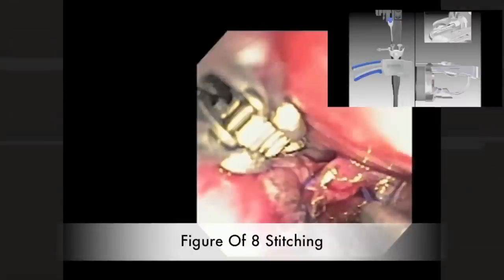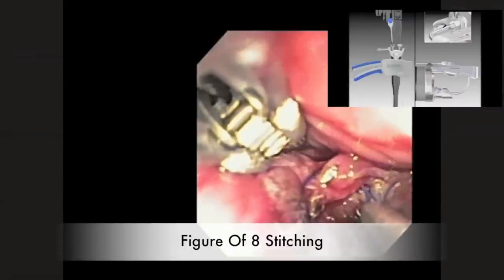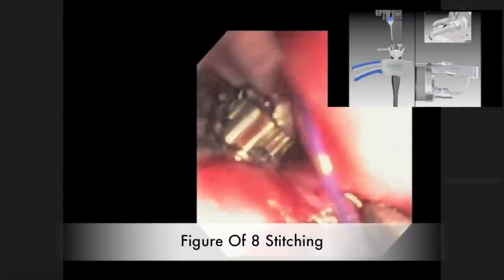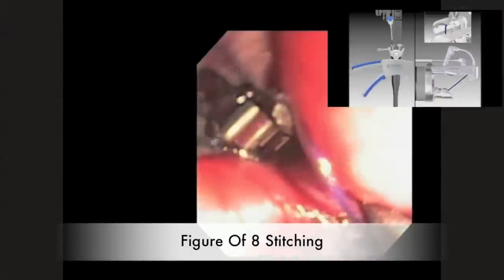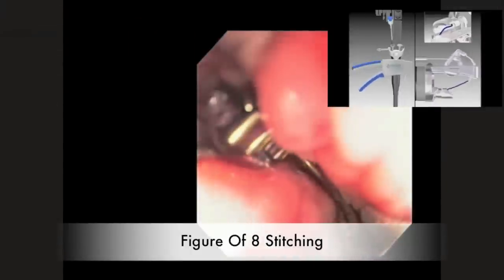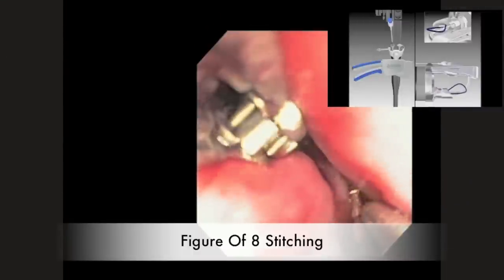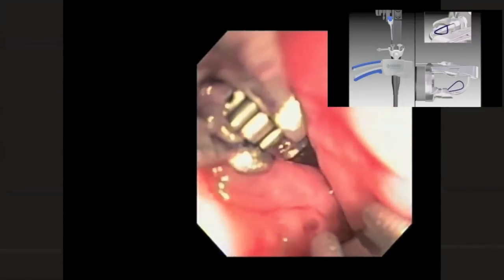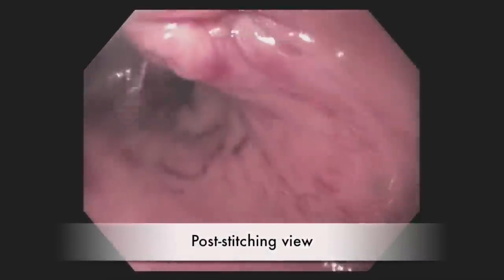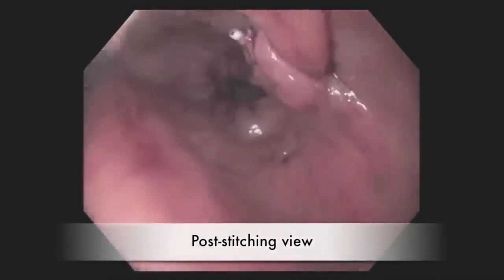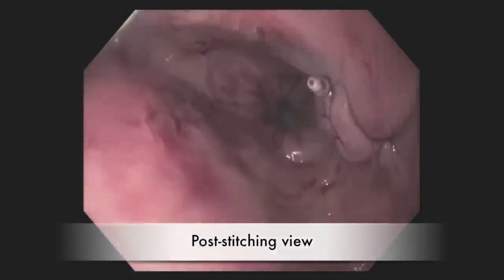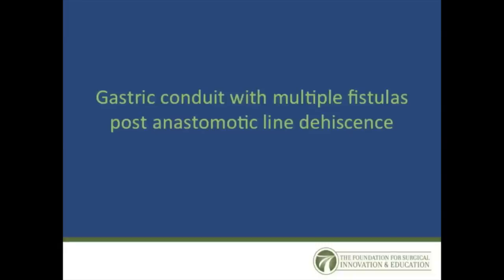A figure-of-eight stitch was placed endoscopically to completely close the perforation. In the top right corner one can see the mechanism of the Apollo overstitch. One can see the post-stitching view with a cinch.